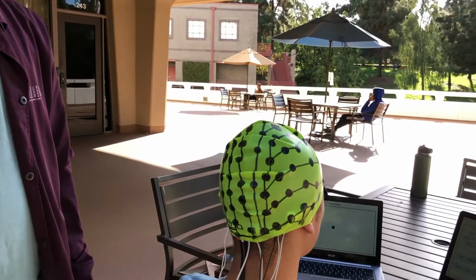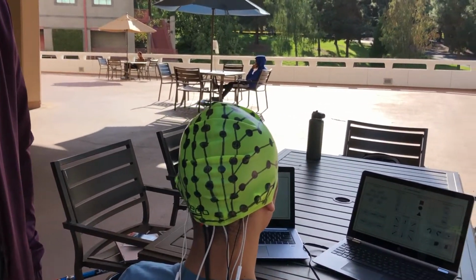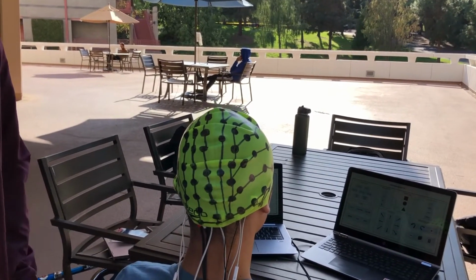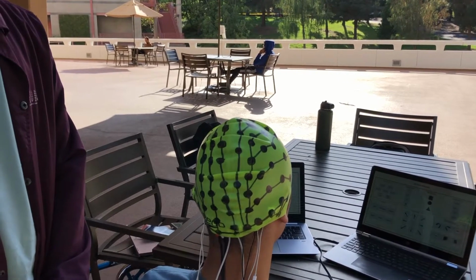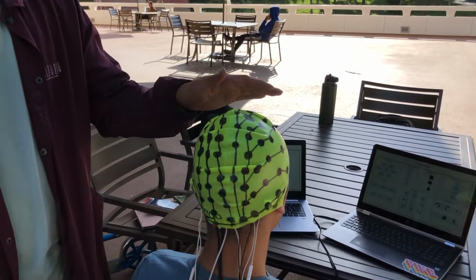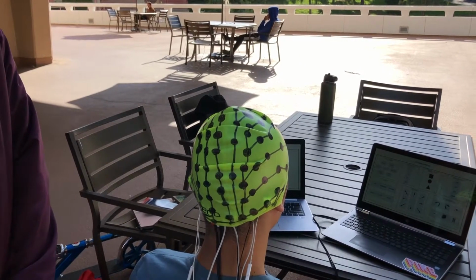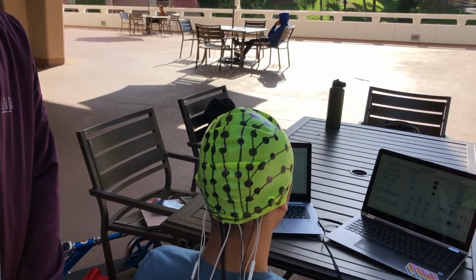My name is Riley. Allow me to explain our device. Our EEG BCI system will use a standard 64-channel electrode cap with 26 to 32 electrodes on the scalp. The EEG BCI system will be optimized in order to detect the SSVEP signal, P300, beta and mu signals generated by the patient's brain. The P300 signal distribution is known to be centroparietal with high amplitude across the midline scalp. The beta and mu signals will be acquired by electrodes placed directly over the sensory motor cortex. Upon the initialization of the painting session, the user will be guided through each frame automatically to set up the default settings for the specific session.